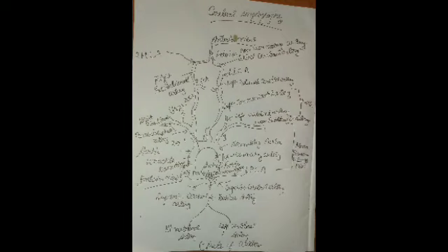If we see from right to left, we get the first branch, second branch and third branch immediately. The first branch from the right side is known as the brachiocephalic artery. The second branch has only one branch, that is the left common carotid artery. And the third branch gives the left subclavian and left vertebral. Once it is introduced from the arch of aorta, it immediately gives branches. So we have three branches.